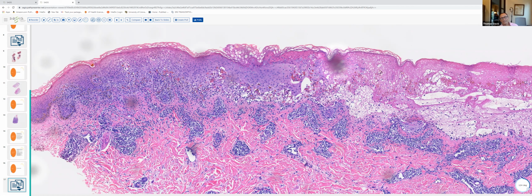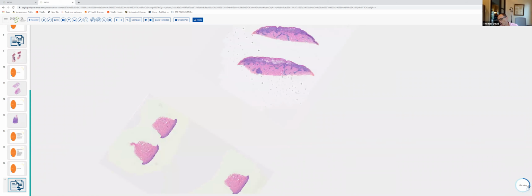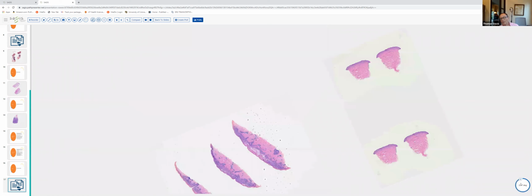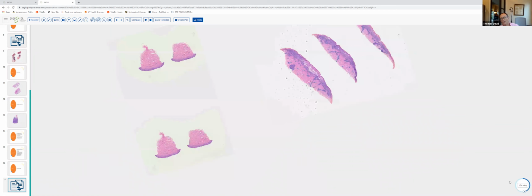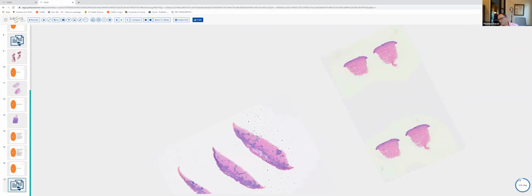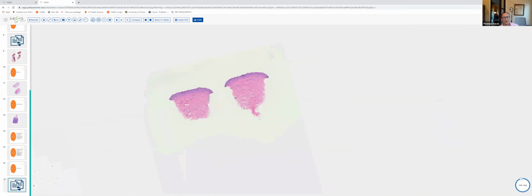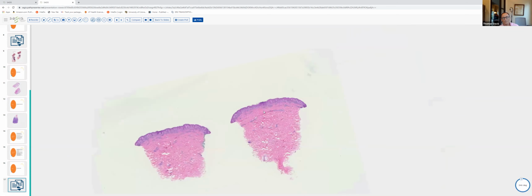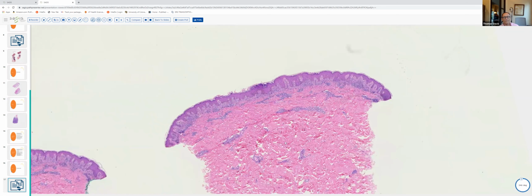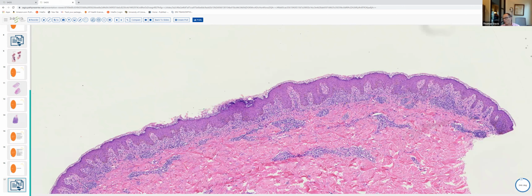Now I find the entity that causes most difficulty, and we've discussed this in other happy hours before, with Erythema multiforme is fixed drug eruption. And that's because the two can show very similar changes along the dermal epidermal junction. So over here, we've got a bisected punch biopsy. This is a fixed drug eruption. And as we zoom in, here we've got a basket weave cornified layer. While we like to see a basket weave cornified layer in the setting of EM, in fixed drug, sometimes the cornified layer is basket weave, it may even be parakeratotic.